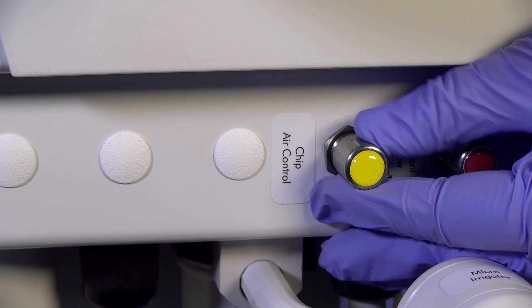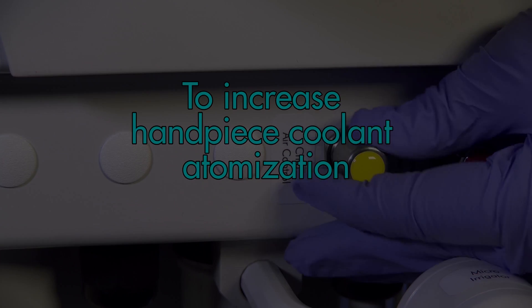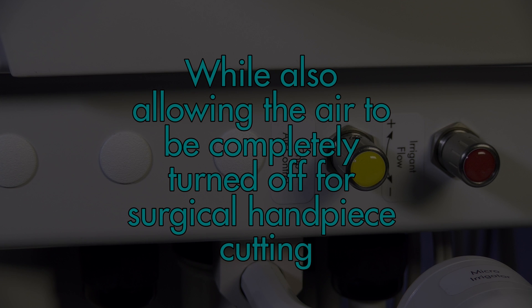The chip air control can also be adjusted to increase handpiece coolant atomization while also allowing the air to be completely turned off for surgical handpiece cutting.